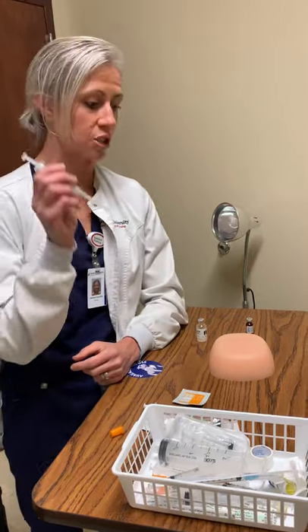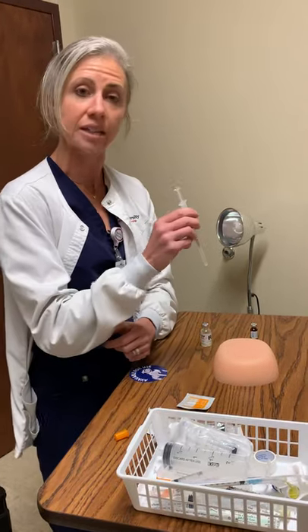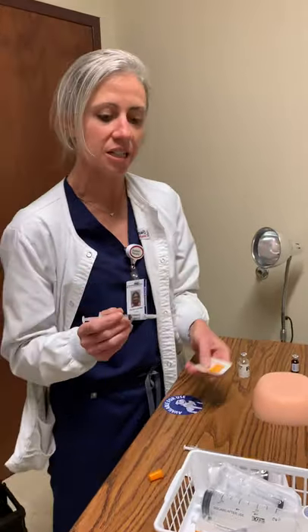IM is always going to be given at 90 degrees — straight down. I always tell people it's like throwing a dart: you want to be as straight as possible, not coming in at an angle. It's the same as a subcutaneous injection — we're coming in, telling the patient, checking if they've had a shot before. Some people pass out with injections, so ask: have you had a shot before? Have you done okay with it?